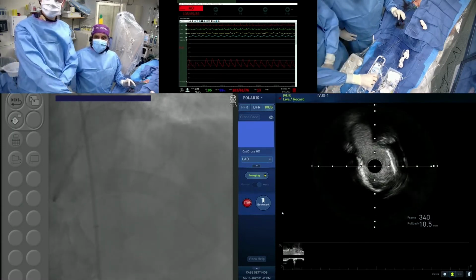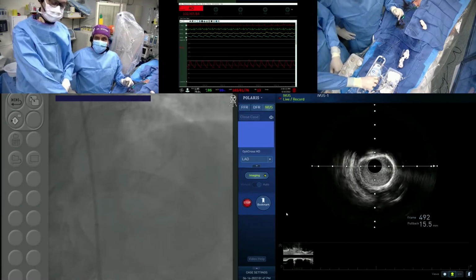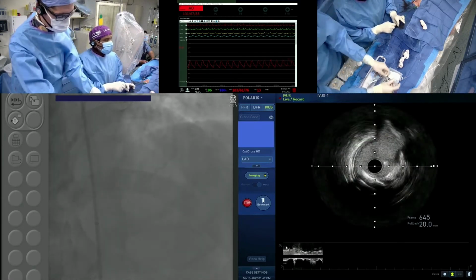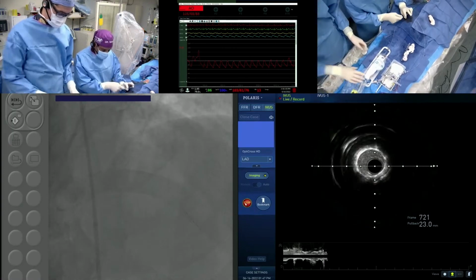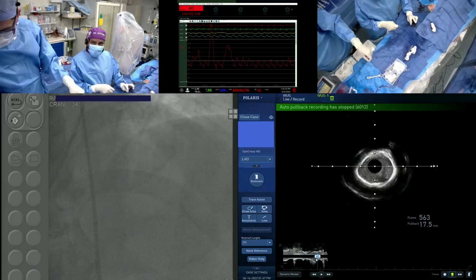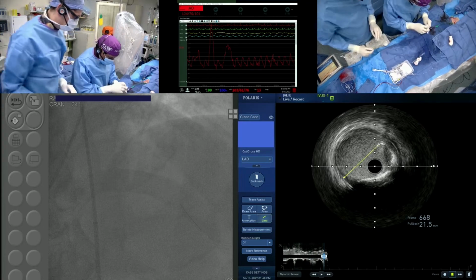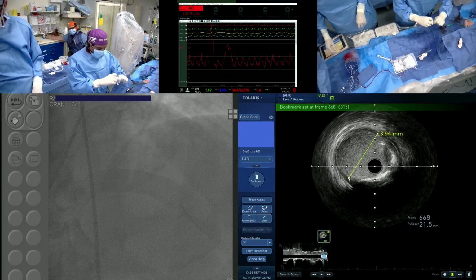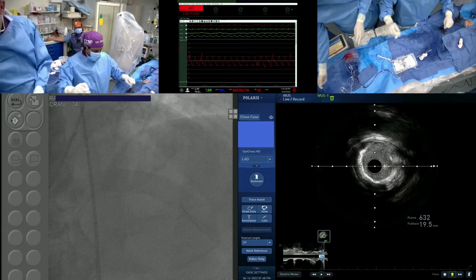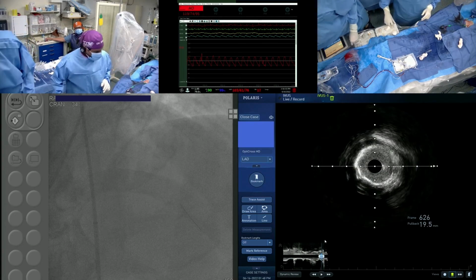And then there should be a very tight lesion after that. Yeah, it's also 270, full circular calcium. Yeah, 360 calcium. 1.5 will be okay. Diffuse 1.5. All right, let Ran and others tell us what we do after this. Okay. It didn't go after that aneurysm, which is okay. But we saw that circular calcium before the aneurysm and a little bit at the distal part. The question is, I know that if IVUS did not go through, IVL alone will not work. So we are here with a 1.5 ROTA bar and ready to do a rotational atherectomy unless there is some objection.